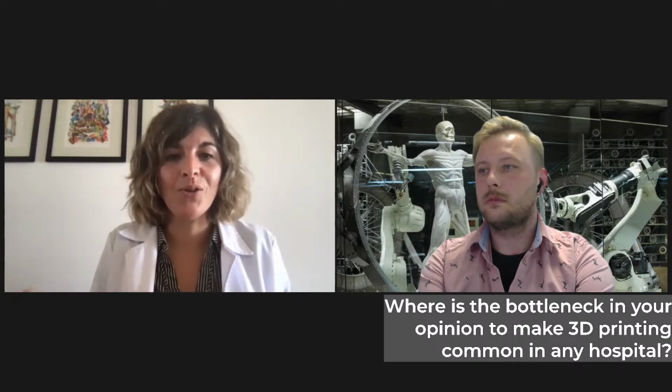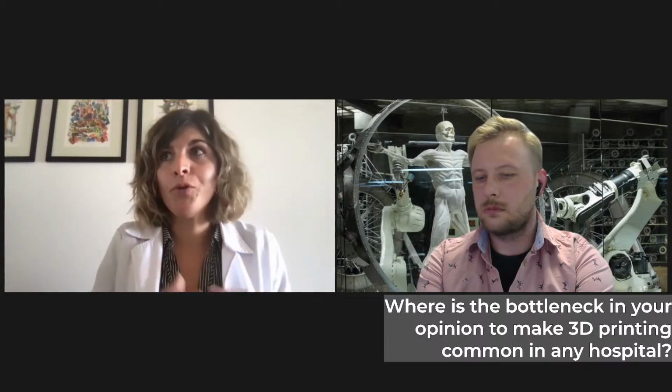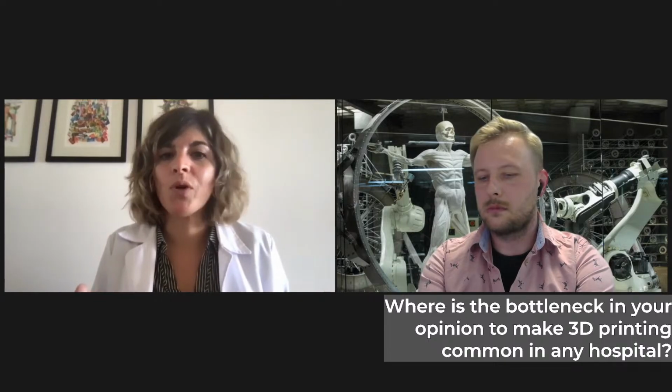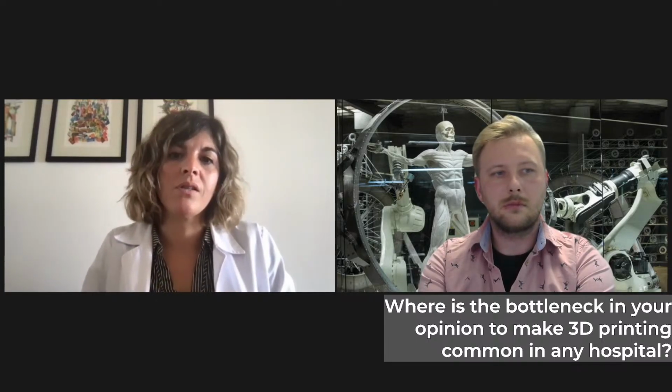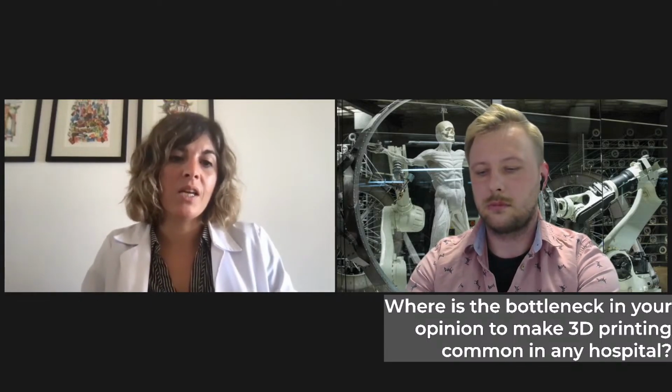That's a very nice thing in the world we live in. Globalization is great, so we can get images like this, it's just one click away, and things like the 3D printed model are just a few days away from whatever part of the world you are. So there's no excuse. That's what I would say. There's no bottleneck. We just need to start using it. Most of it is education. So if our own colleagues, surgeons or radiologists or people at the hospital that make the big decisions know that this is available and they can use it, I think that's the biggest bottleneck.